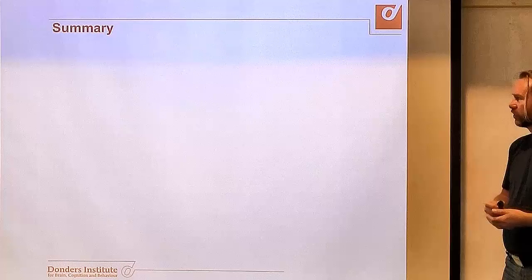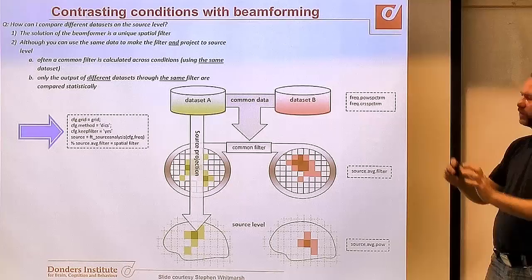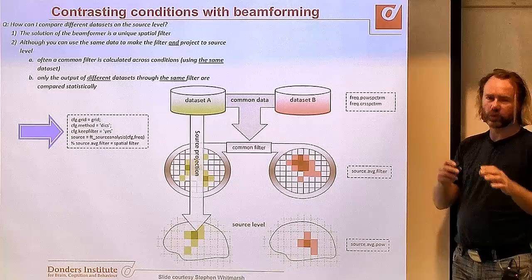So we typically do two analyses. In the first analysis, we're focusing on the computation of the spatial filters, and in the second analysis, we apply the spatial filters to one of the two experimental conditions.